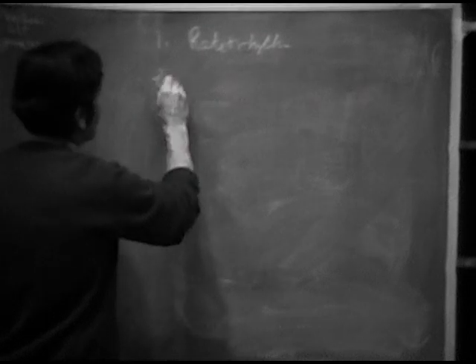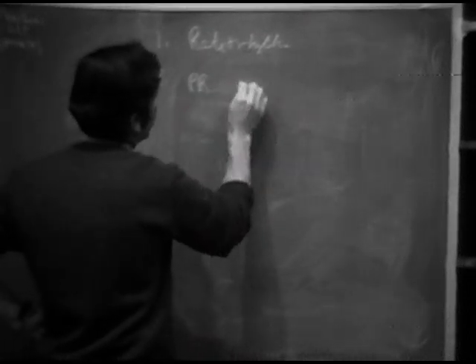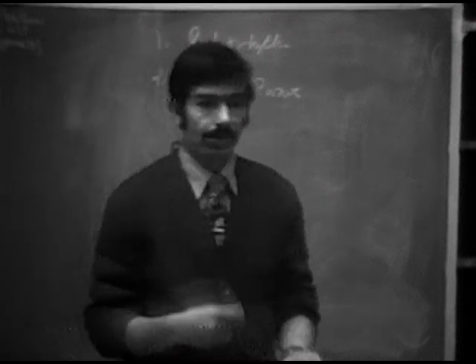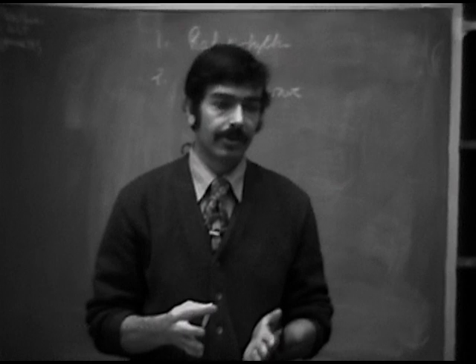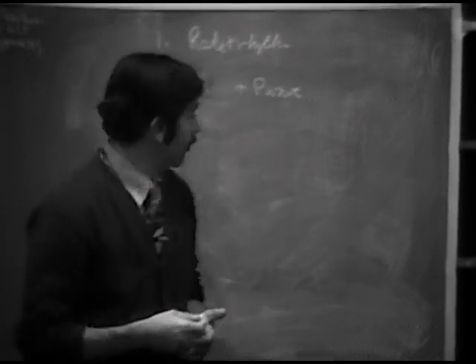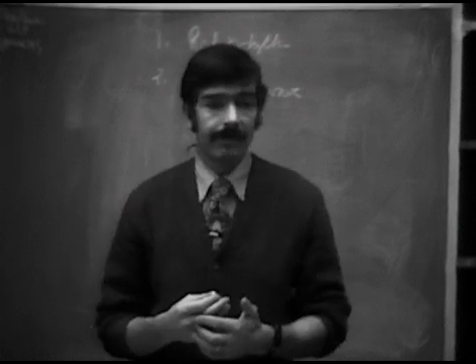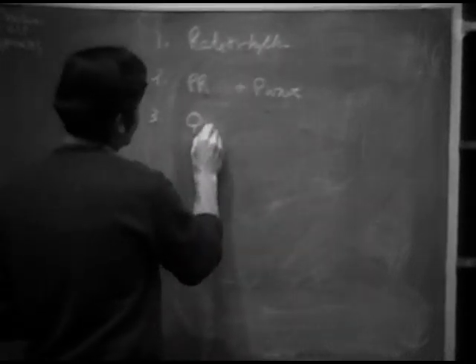Okay? Next thing you might look at is the PR interval and the P wave. And here you'd pick up things like first-degree block, and you might suspect nodal rhythms or Wolff-Parkinson-White, just on the basis of too short a PR interval. Heart block on the basis of a PR interval that is prolonged. Okay, the P wave, look at the P wave and you decide whether the patient has right atrial, left atrial enlargement. Right? The next thing you look at is the QRS complex.